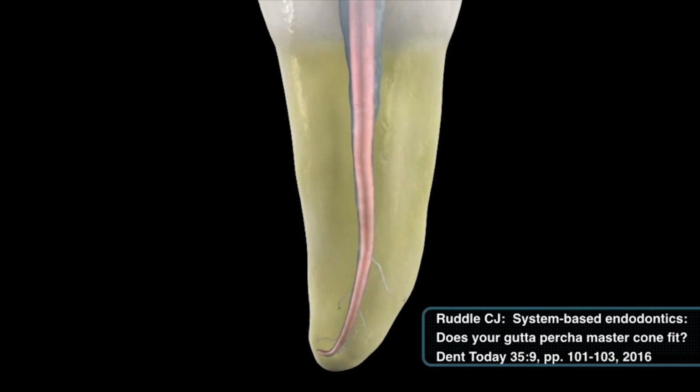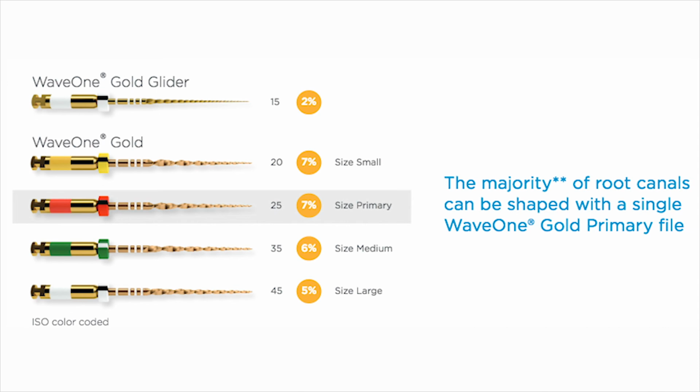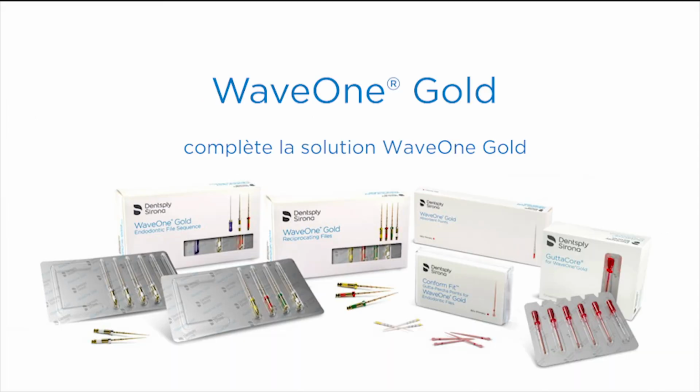And you would use this method and so forth to see if you want to go to the large or not in those instances where there is a big system with a big apical diameter.